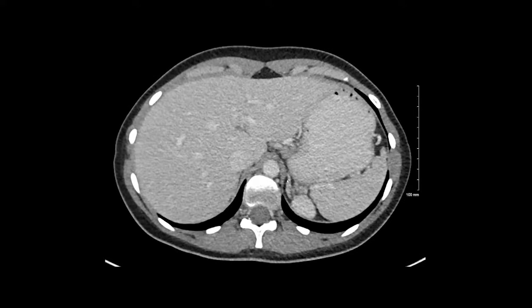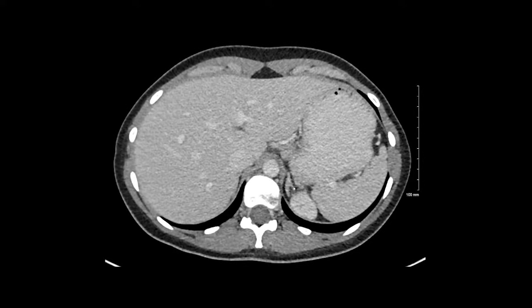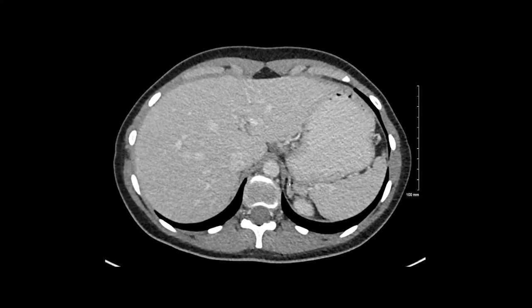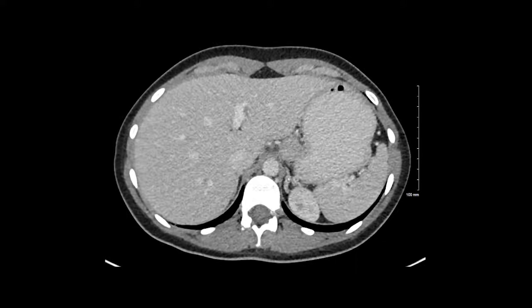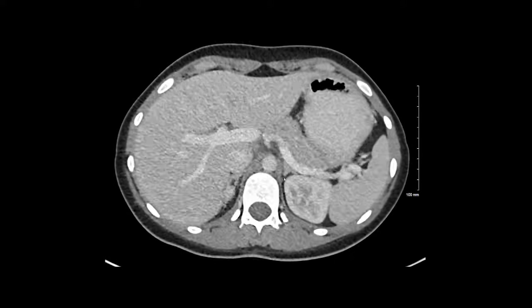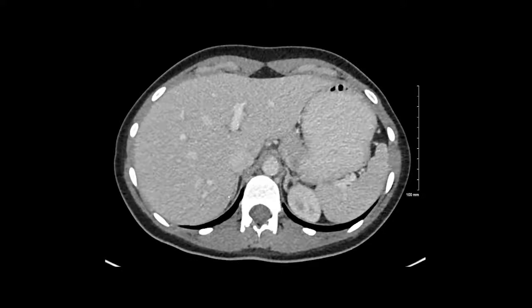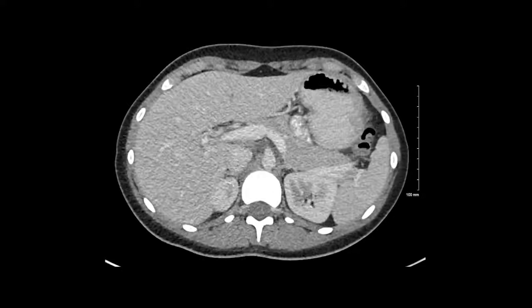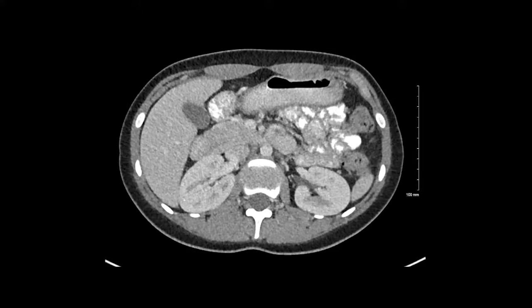I will then move to the adrenal glands, which sit just above the kidneys. You can see the lateral and medial limbs of the left adrenal gland here without any nodular mass. We'll then look at the right adrenal gland, and next we'll move on to the kidneys.